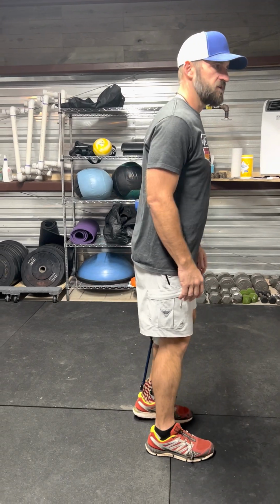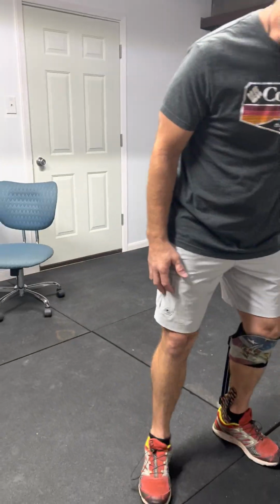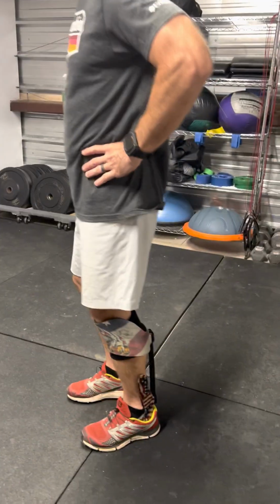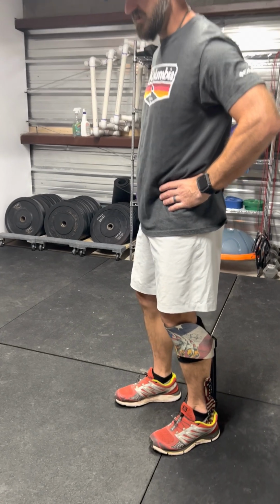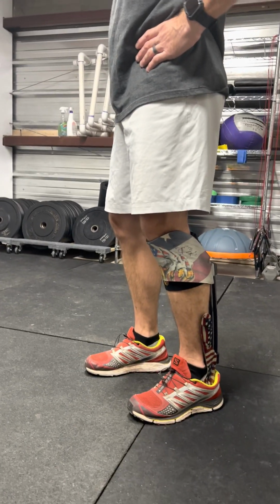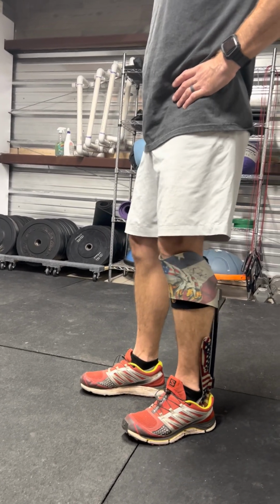What else am I hitting, Hillary? So when you're standing for a long period of time, you can really be lazy. You can see how I'm just kind of hanging out here. You can watch the struts whenever I'm standing here, and I'm literally just hanging out. And so I bend my knee a little bit, and I can just hold on to that right there all day.